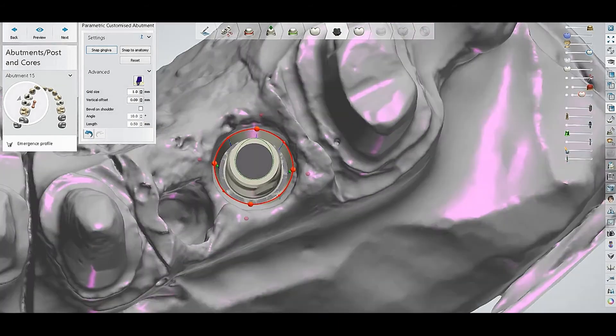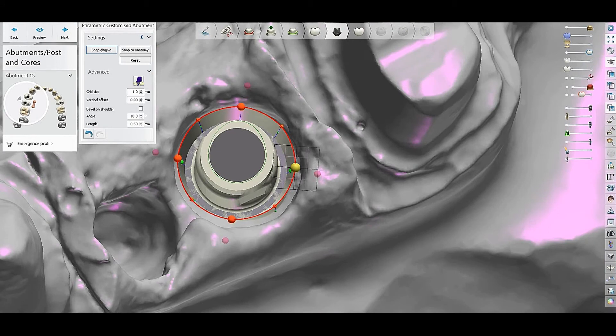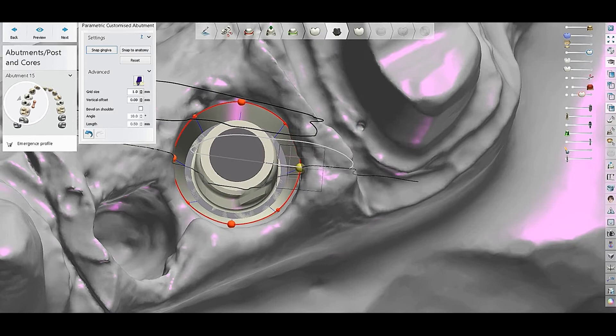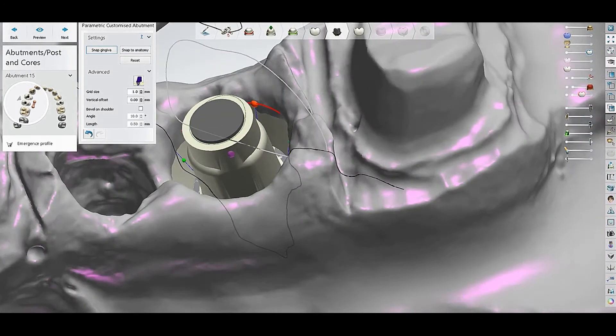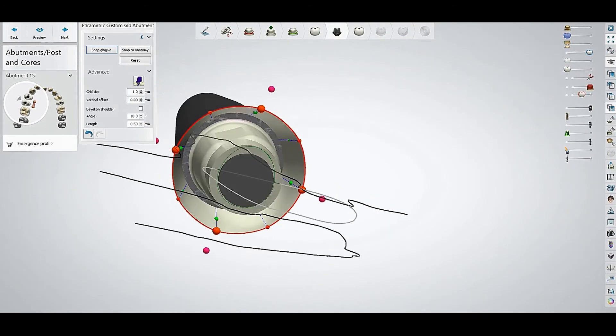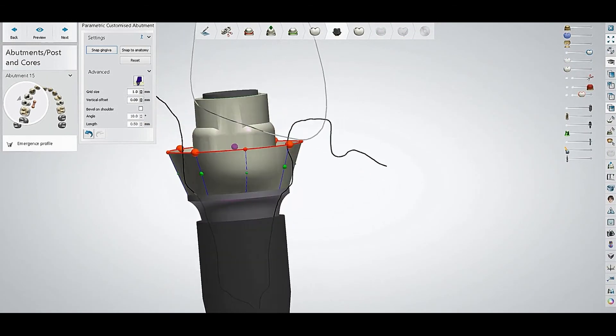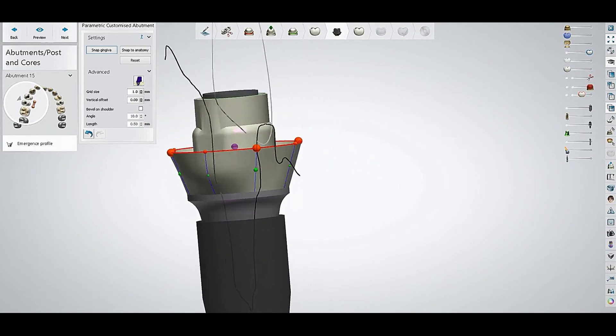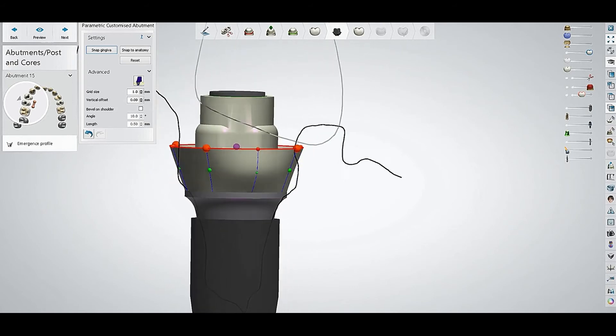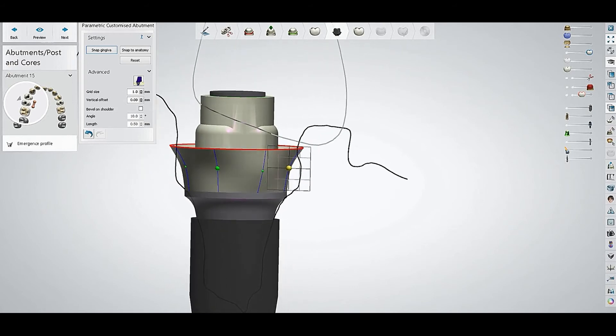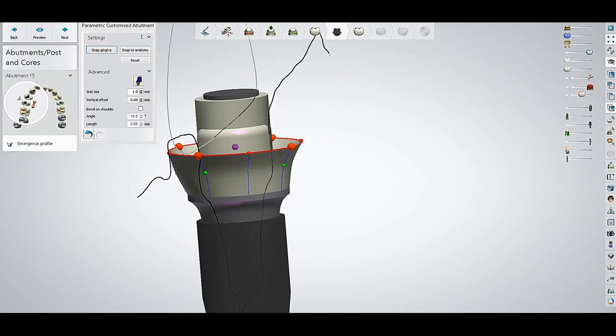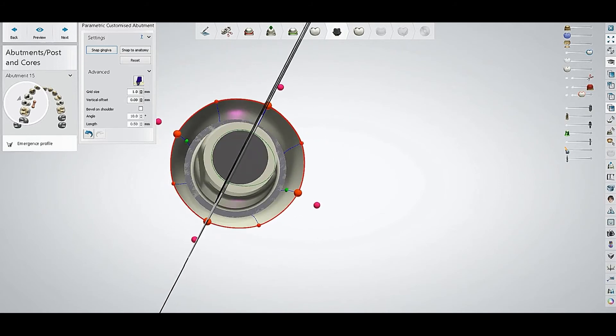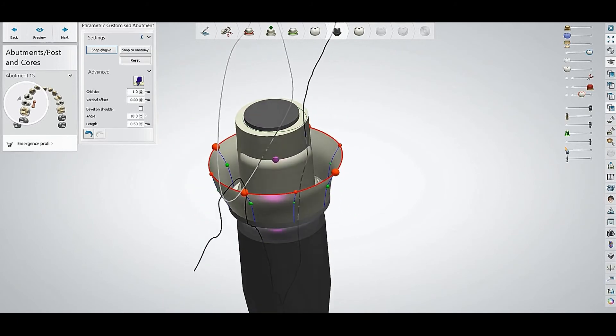We will just select control, and then we will make the emergence profile a little bigger. Select control and with the left click, control and left click, we will make the emergence profile of that implant a little big. After doing this, let's see.